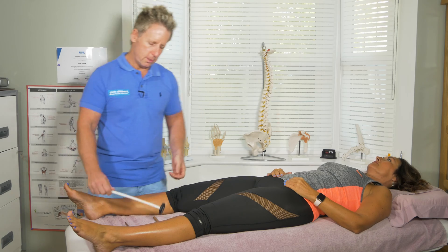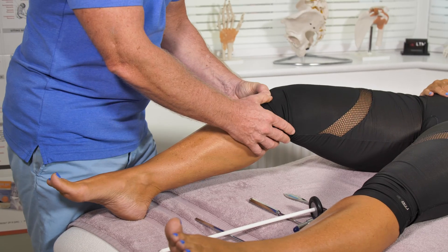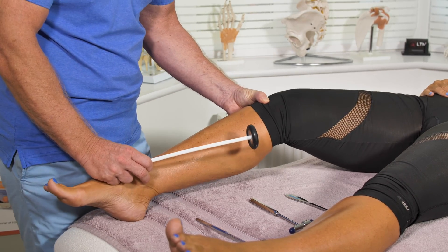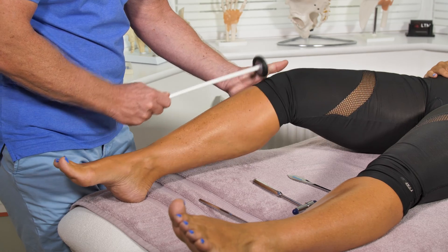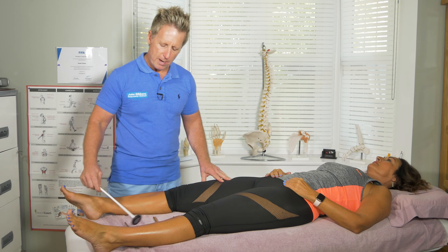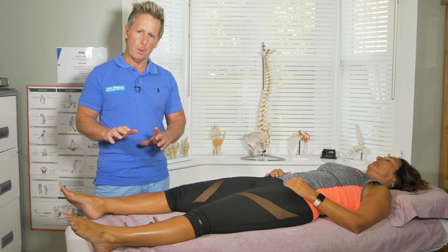When I test L4, I'm going to bend my patient's knee, find the patella tendon — or the ligamentum patellae, as it's medically known. I tend to hold the hammer with my finger or thumb, find the tendon and just tap. And then you can see there is a response within the quadricep. That would be known as two pluses.